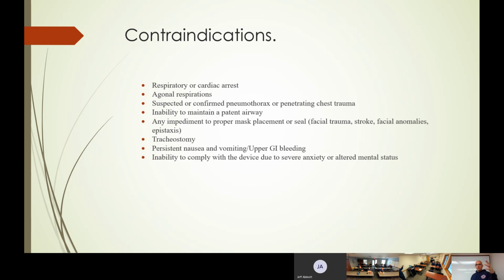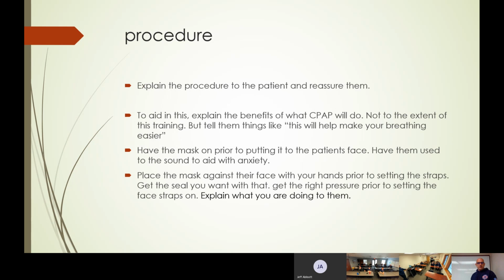Before we start cutting on cars, we really preach, hey, explain to the patient what's happening. Well, you're going to hear a bunch of noise. You're going to feel the door move and this, that, and the other. No different for this situation. Make sure they know what's happening. But the last thing you want to do is like, look, you need this, just go for it, take it. That's not how things work. So again, explain the procedure to the patient, reassure them.